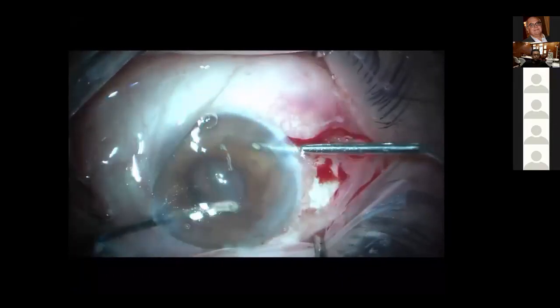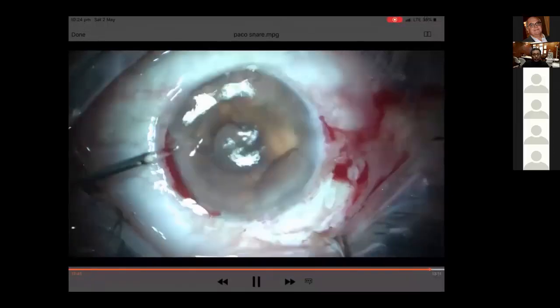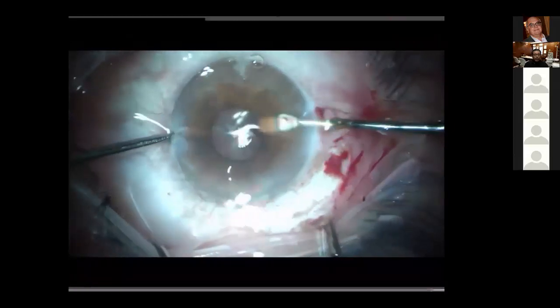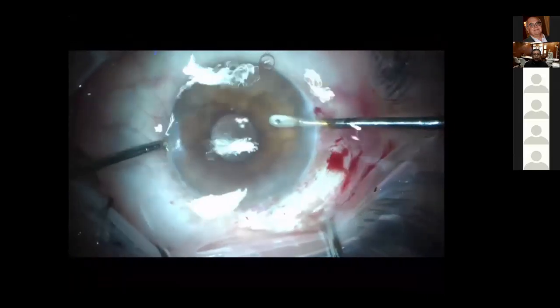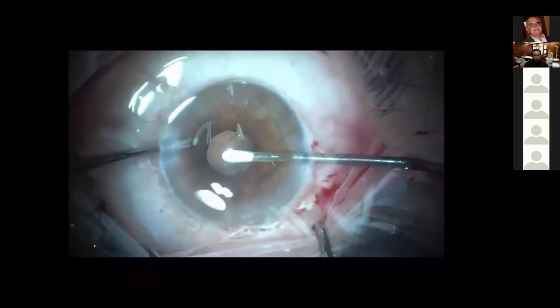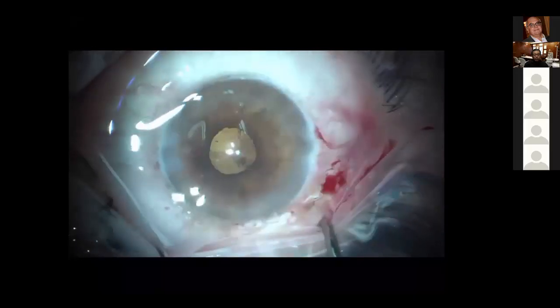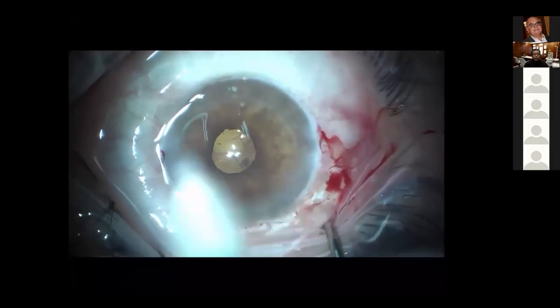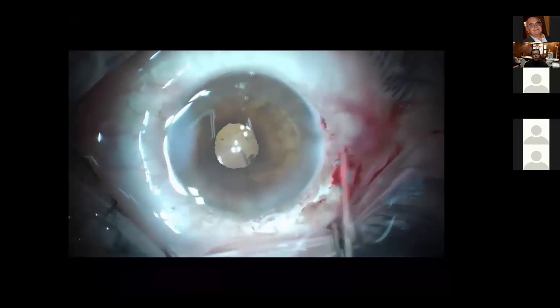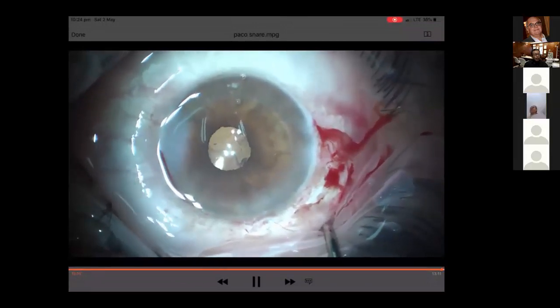Very interesting. Dr. Wael, what's your comment? It's a very interesting case. I would like to ask, when do you opt using this technique rather than phaco? Because I can see you're using the phaco machine. So when do you choose to do this technique? I'm using the phaco machine only in irrigation aspiration. Okay. Which you can use the double way. Of course. Yes, but it's quite faster to use the phaco machine.